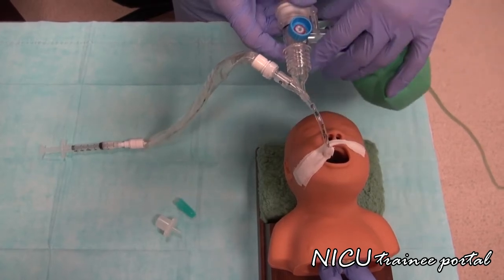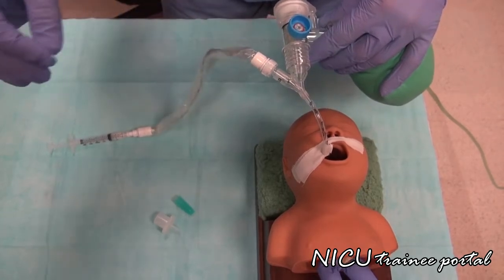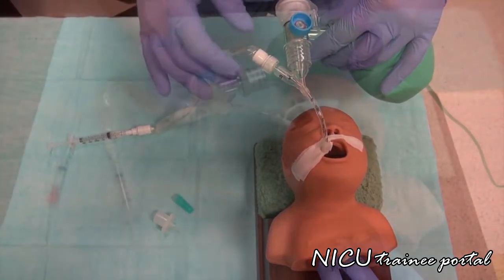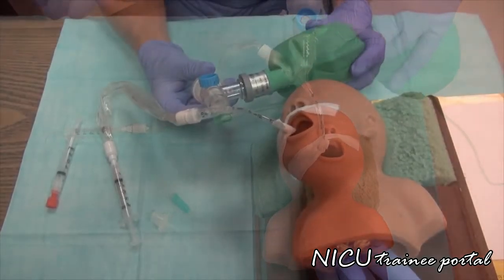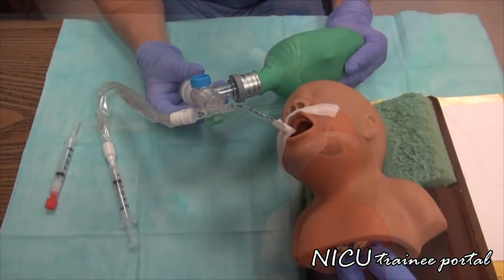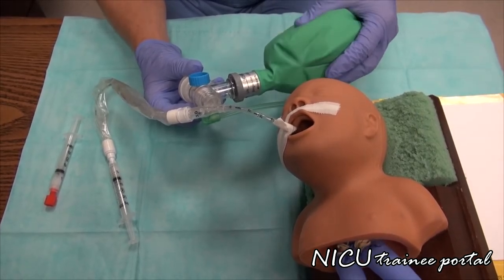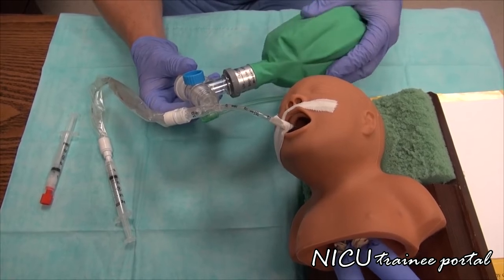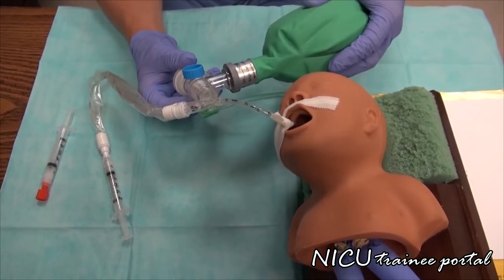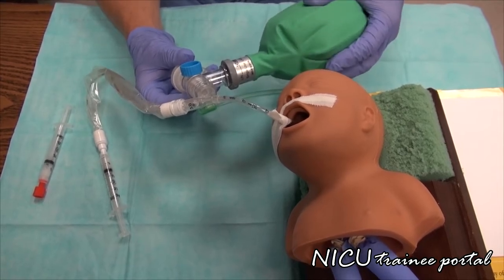That's the demonstration of inserting the catheter, and we can also demonstrate giving both aliquots, listing the baby to the right and to the left. Okay, so here we have the baby listed on his right side or her right side. We are about to give the first aliquot.